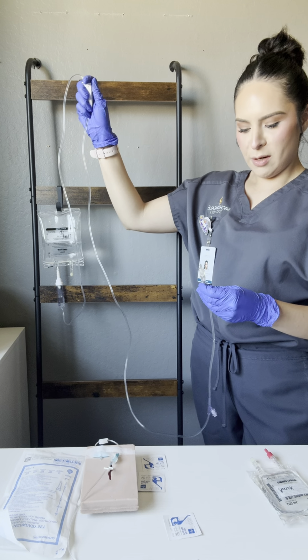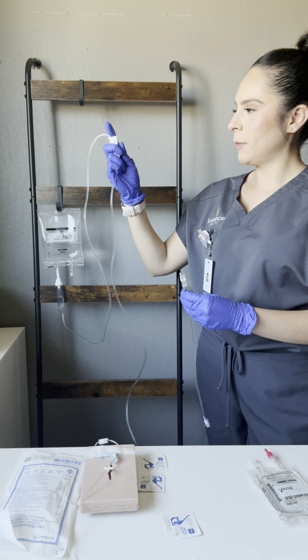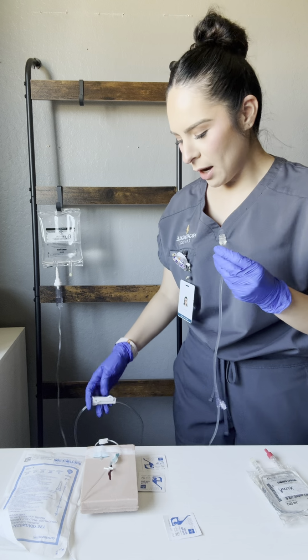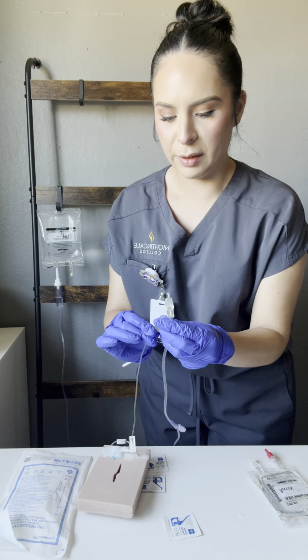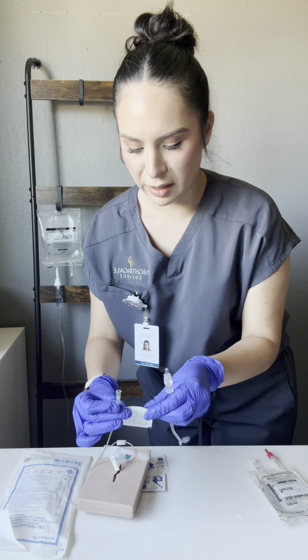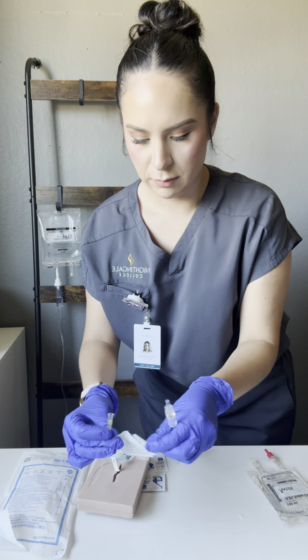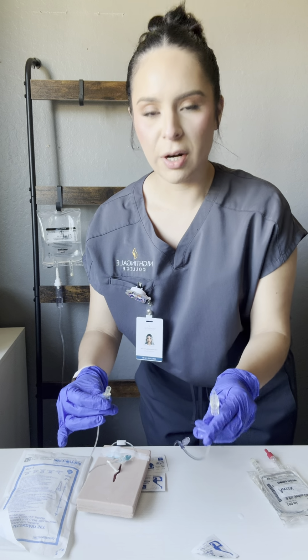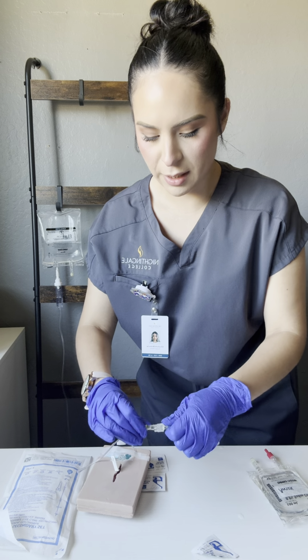Okay, there are no air bubbles, so now I am going to roll down on the roller clamp, and then I am going to attach this to the luer lock. So I'm going to remove the end cap from the luer lock, and then I'm going to grab an alcohol pad to clean the end of the luer lock. Cleaning the end of the luer lock and letting that air dry for 1 minute. Then I'm going to attach the end from the adapter end.